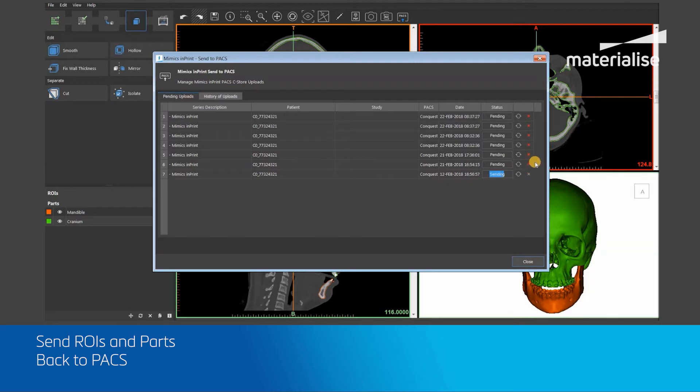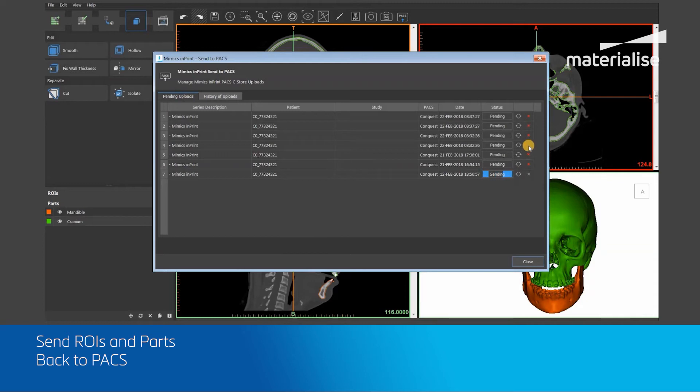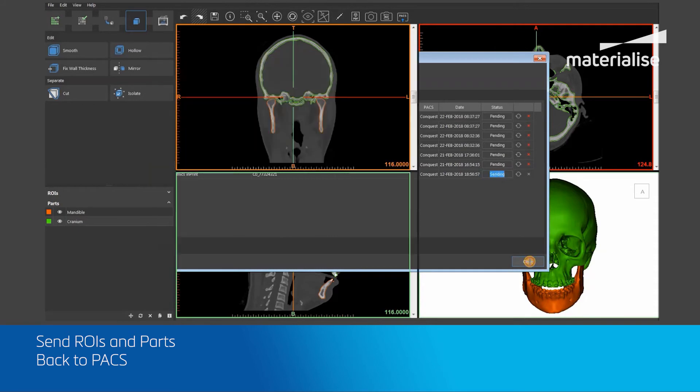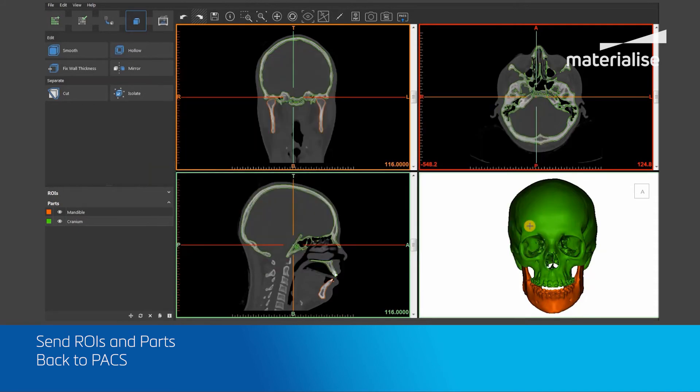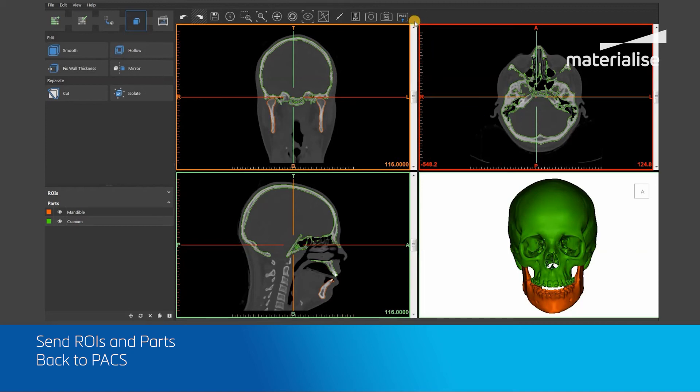You can also retry uploading a file by pressing on the green reupload button. Once your required files have been uploaded to PACS, you can close the dialog box by pressing the Close button. Any pending uploads will still keep uploading to PACS even after this dialog box is closed. You can also reopen this dialog box after closure by hovering over the general toolbar and selecting the Review PACS Uploads button.